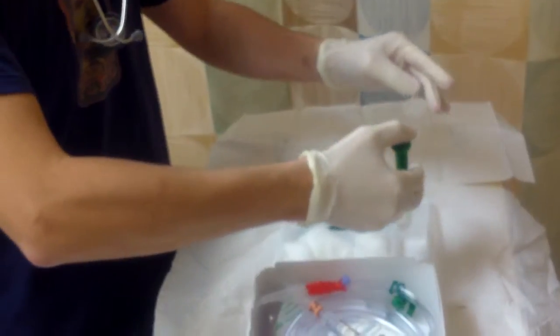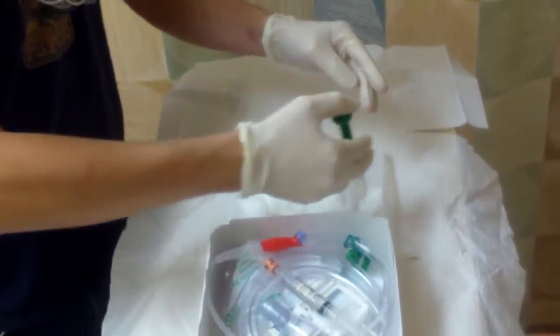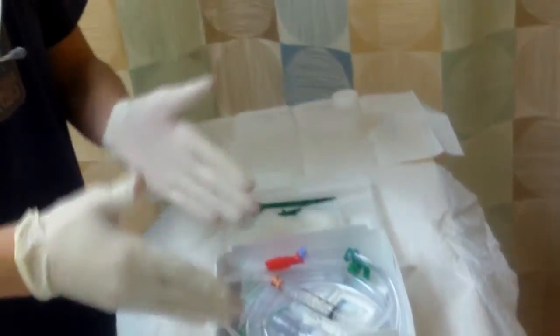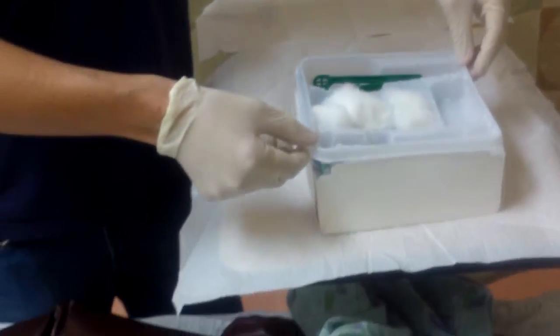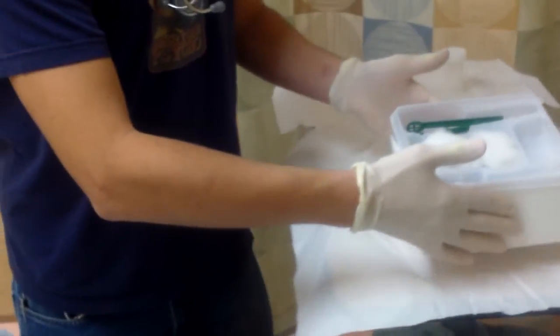Okay. I would then squirt this in this little container that is provided right there. So that's done. There we go. And now I have both my trays set up. So this is both sterile. So then I would put that back on top of the tray really quick. And then I'm going to move my box, which is still sterile, onto my sterile field.